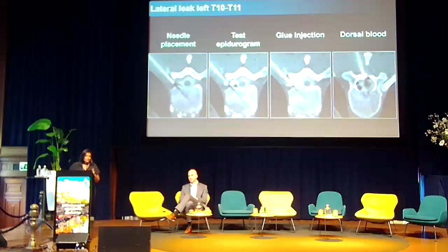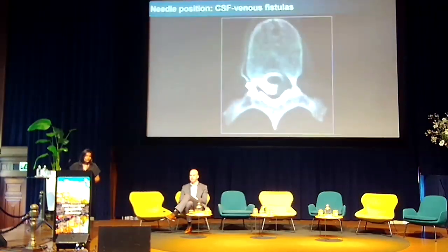And when it's acute, we've also been giving some dorsal blood at that level because we feel that helps wrap around the glue. That's not really scientific, and in the lateral leak paper, we found that there wasn't actually any difference for what substrate you used for that.